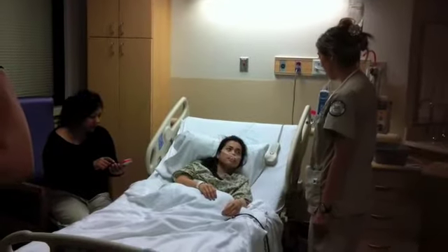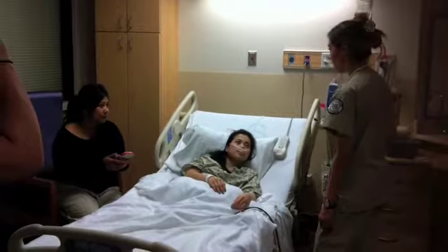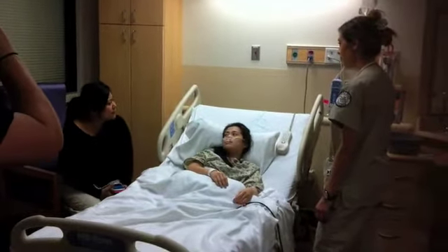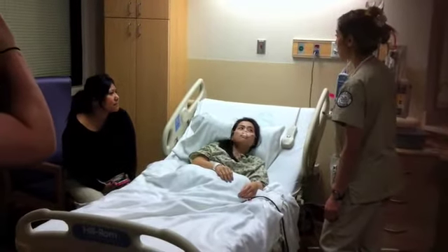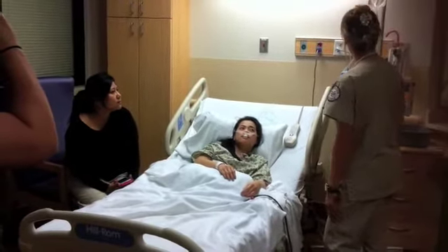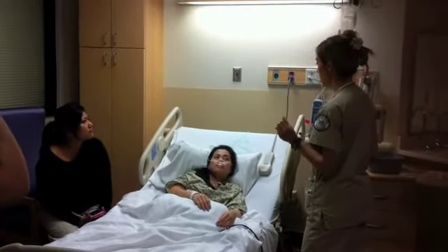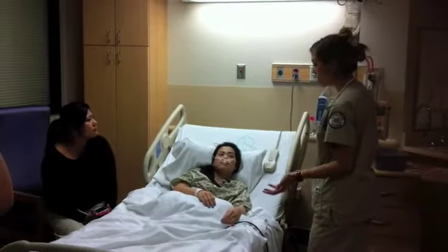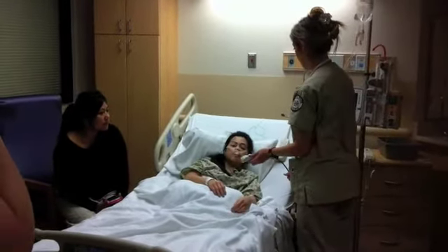I'm your nurse for today. I'm going to be giving you a PCA pump to help control your pain. Wait a minute, what is this PCA pump? A PCA means patient-controlled pump, or patient-controlled analgesic pump. So it'll be running a continuous infusion. You'll be getting medication little by little for your pain, and if you feel like you need additional pain medication, you can push this button.